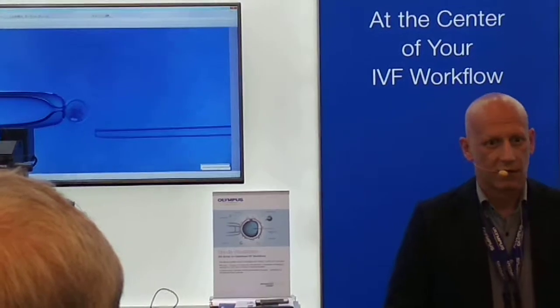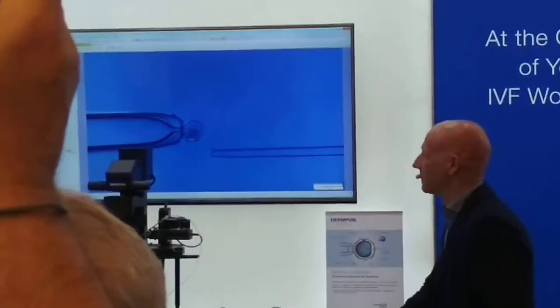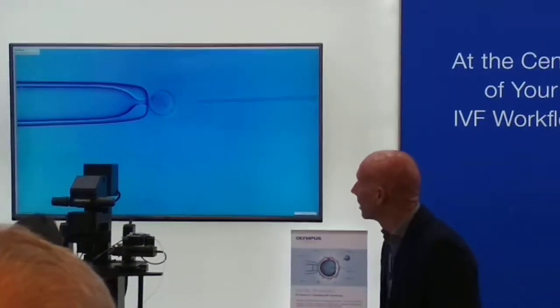Sorry, I've been talking for maybe too long. You want to see the samples, right? So let's hope that we have a nice image. Let's go to live. Okay.